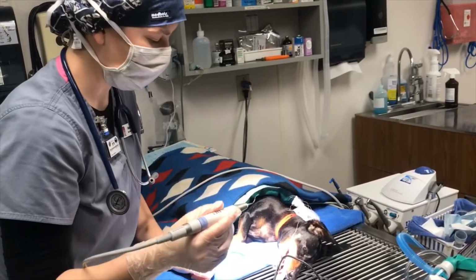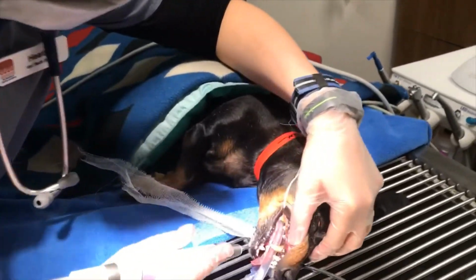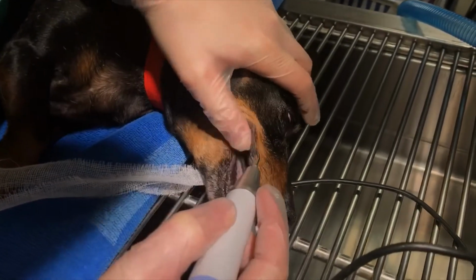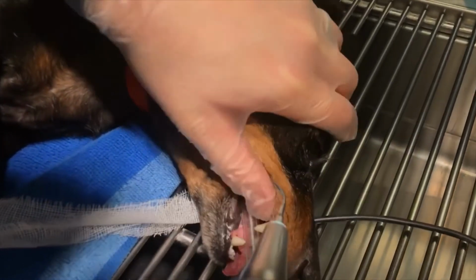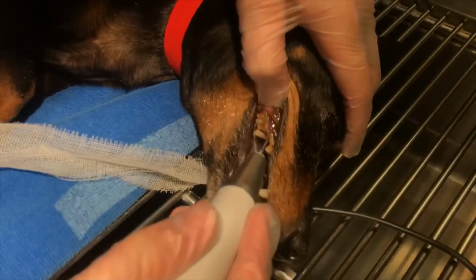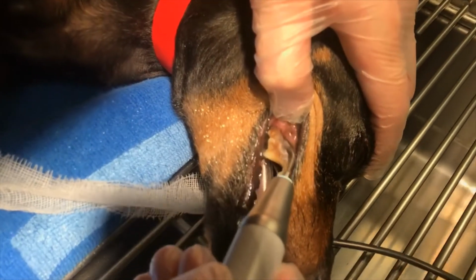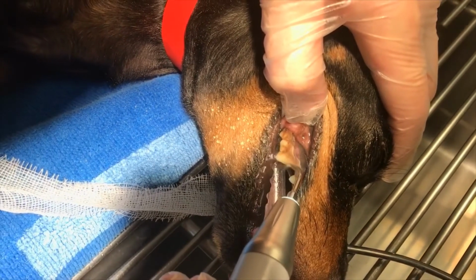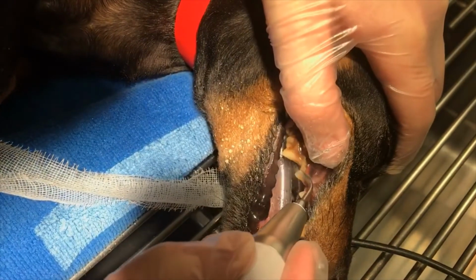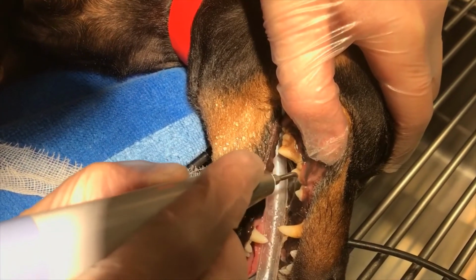Now I'll do some ultrasonic scaling on Gemma here. As I go through, I'll describe the process. I'm just going to start on a couple of her back molars here. See that they are pretty gunky. We do have water, which will help prevent the tooth from heating up, but you still want to have a 10-second contact time per tooth. That way you don't heat up the enamel or the pulp and cause damage. So I just move back and forth as I reach that 10-second time, or even less for safety, and then I move on to the other tooth, and I will continue moving on.